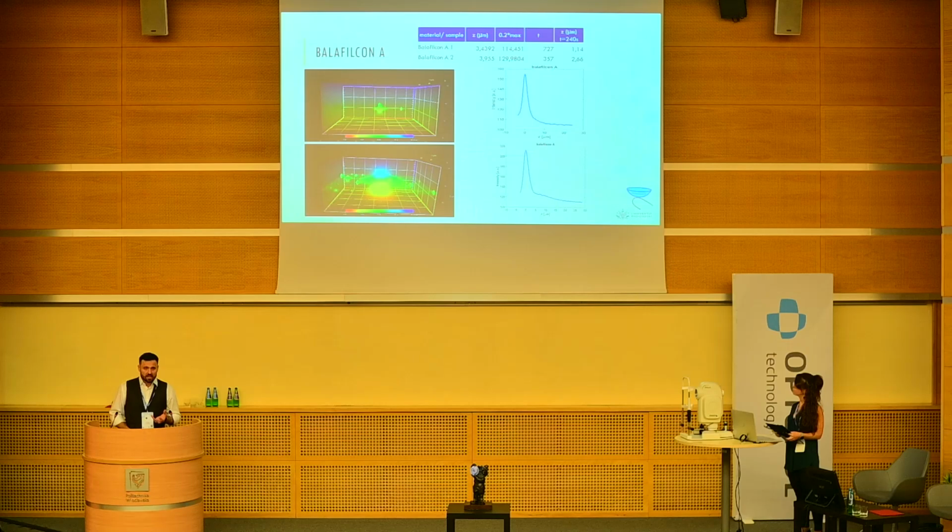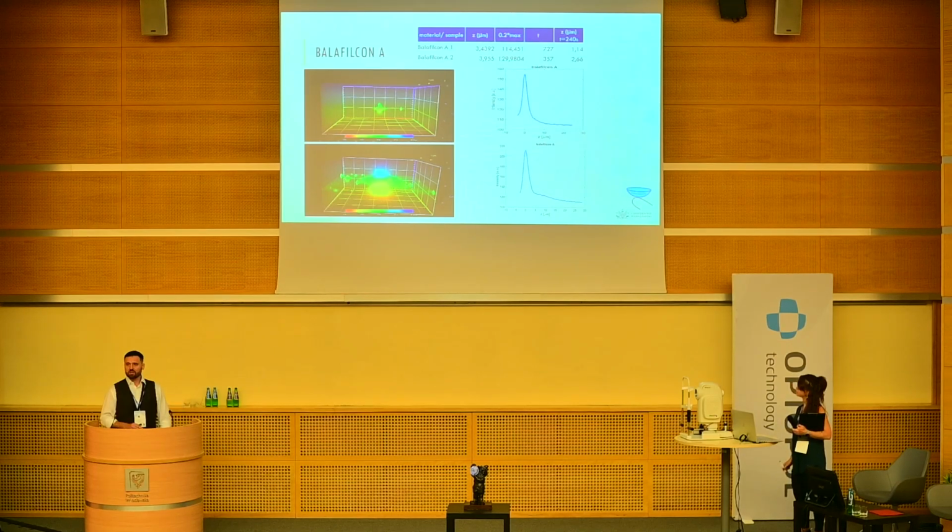But it's actually only a calculation, because it does not show us the real data, real numbers, because the diffusion is not linear the whole time. We know it depends on the concentration. So at the very start, the diffusion will be much faster than in the next minutes. And it will also depend on the lipid size. So we have to take into account not only the concentration and the time, but also the lipid size.